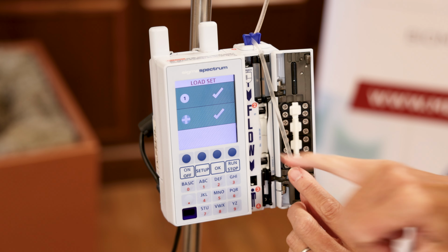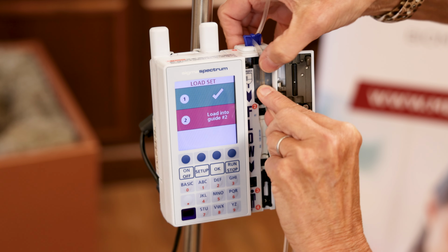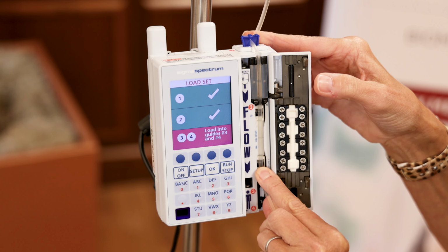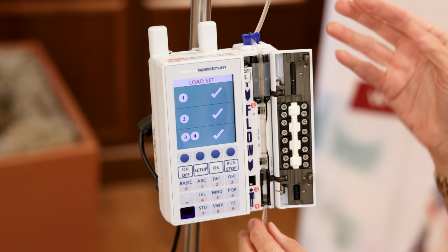And this will do a diagnostic showing you your power status, and then a little map here that you're going to follow on how to load, steps 1 through 4. When you've completed it correctly, you'll get a check mark. There's 2. And then we're working on 3 and 4. And then we're all checked off.